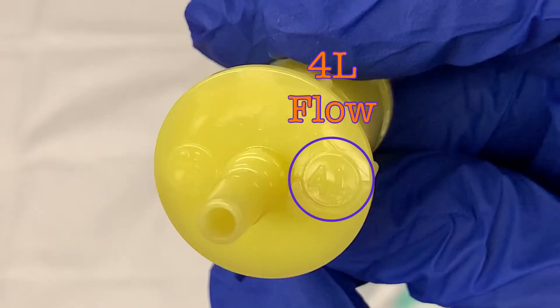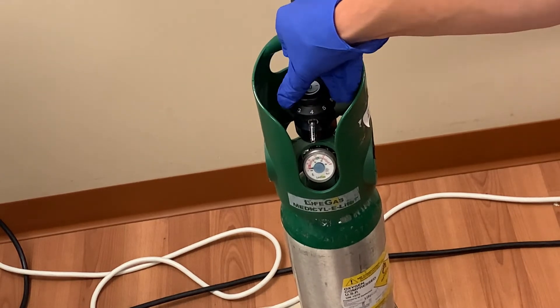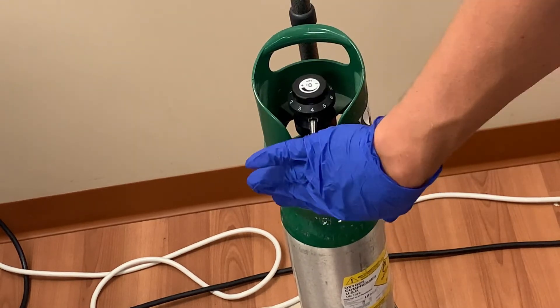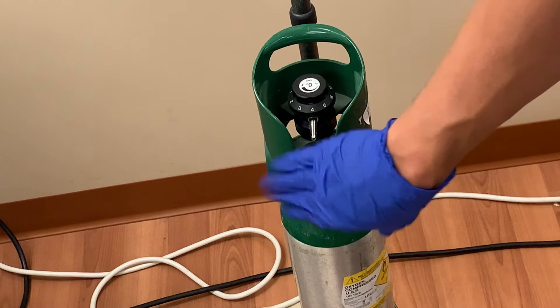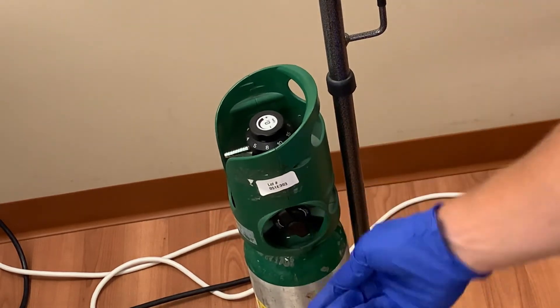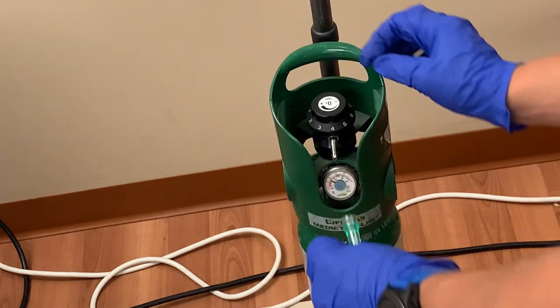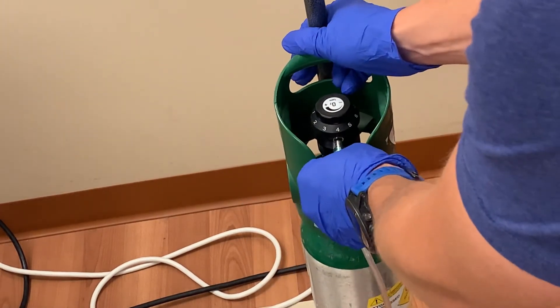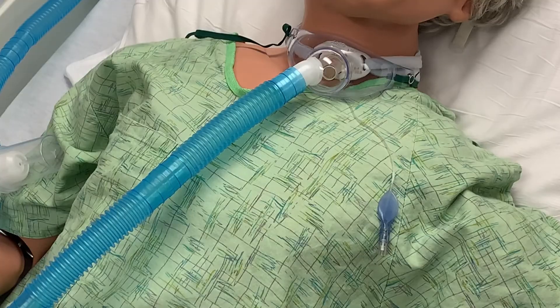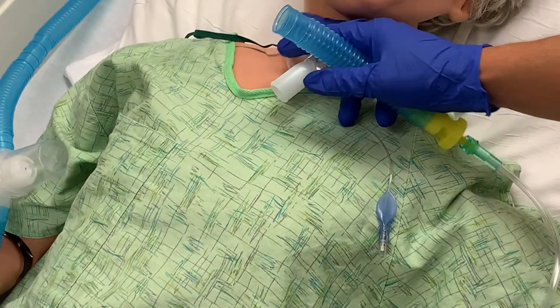The yellow adapter requires 4 liters of oxygen flow, so turn your tank to 4 liters. Test to make sure oxygen is flowing from the tank. If it is not, and you verify that the gauge shows a full tank, you probably need to turn the lever on the side of the tank to open the flow. Once you have oxygen flowing from the tank, attach your oxygen tubing.